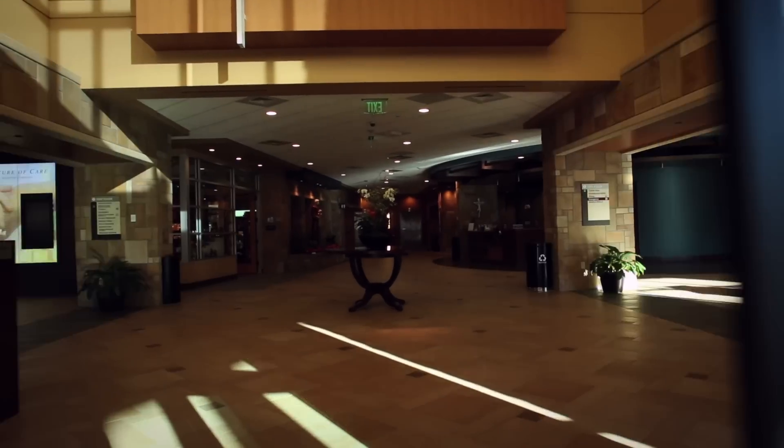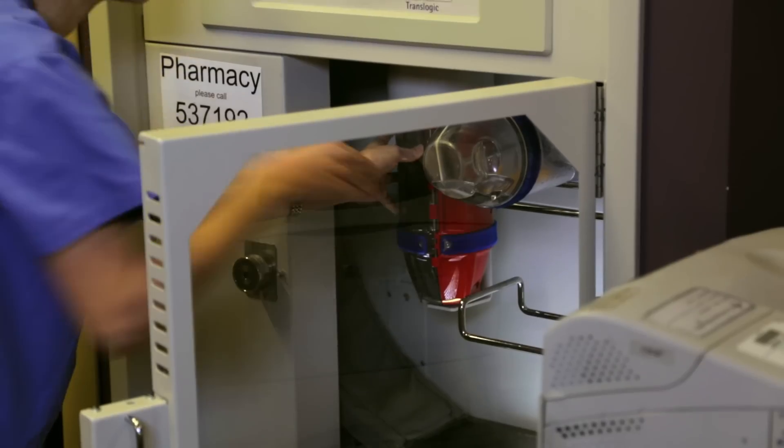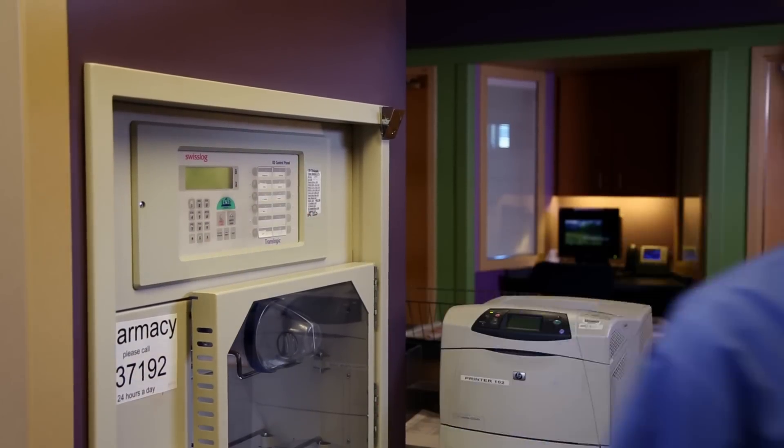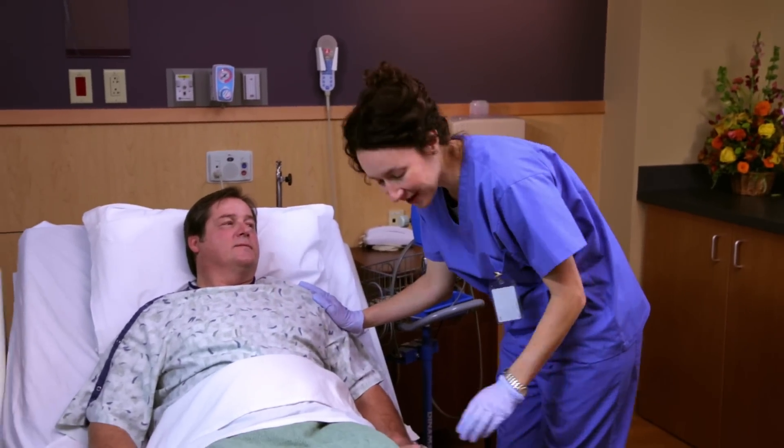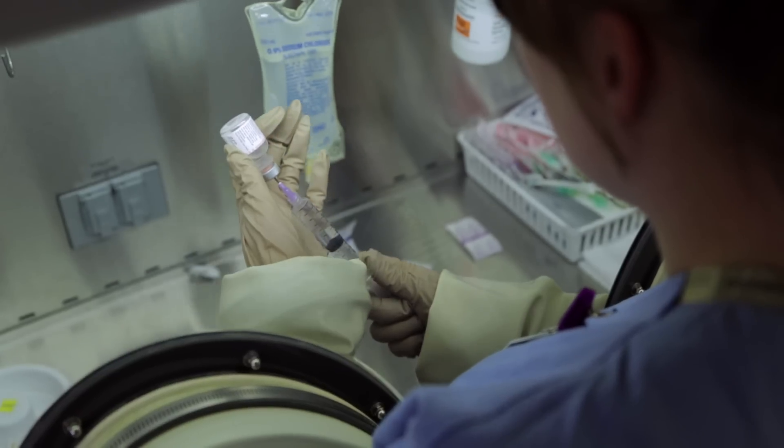When a patient arrives at your hospital, our job begins. A Swisslog Translogic system speeds up the service of care and frees caregivers to focus on their main concern, your patients. From diagnosis to treatment, the Translogic delivery system is ever-present.